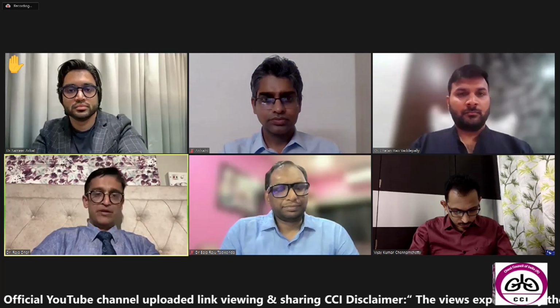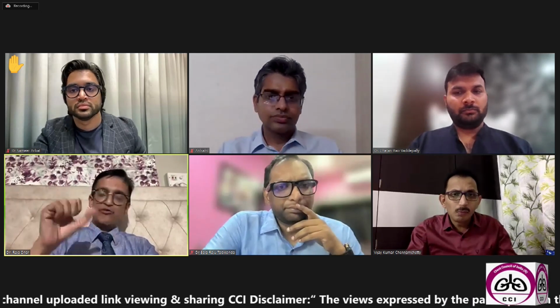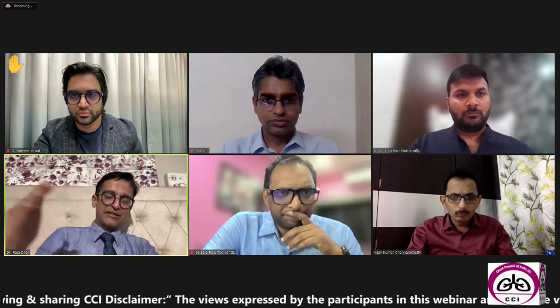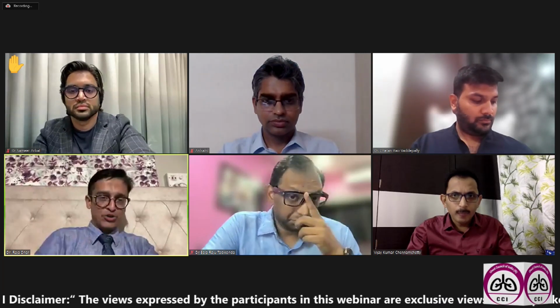Sure. So Sameer, point well taken. I think when you're using shearing force, the question of vasoconstriction doesn't arise at all. The question of vasoconstriction is when you're doing an endobronchial procedure rather than a transbronchial procedure, that you think about vasoconstriction, because of the drop in temperature.